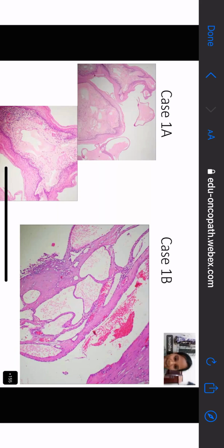Now I want to ask the three of you, well, Limpy is not there, but those who are here, including Dia, do you agree with Dia's use of the word secretion? I said exactly what Dia said. So now, Vimi, you agree with the word secretion? Not the secretion, ma'am.